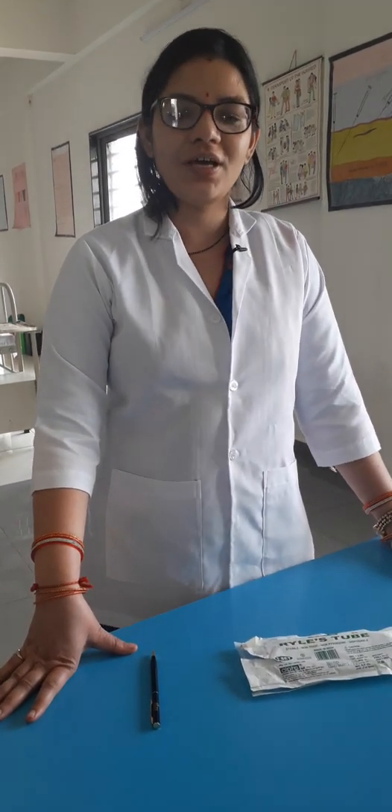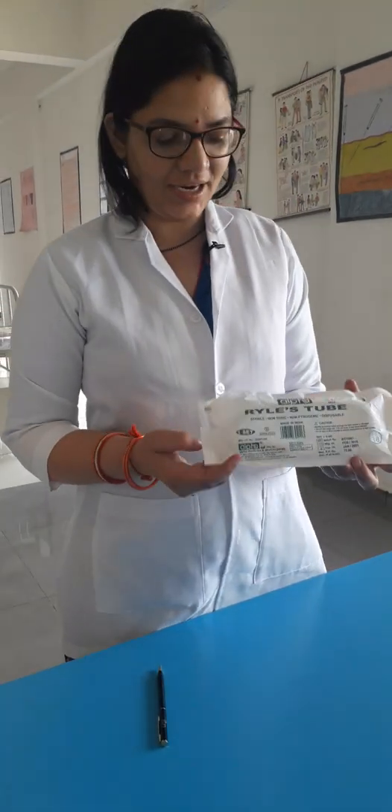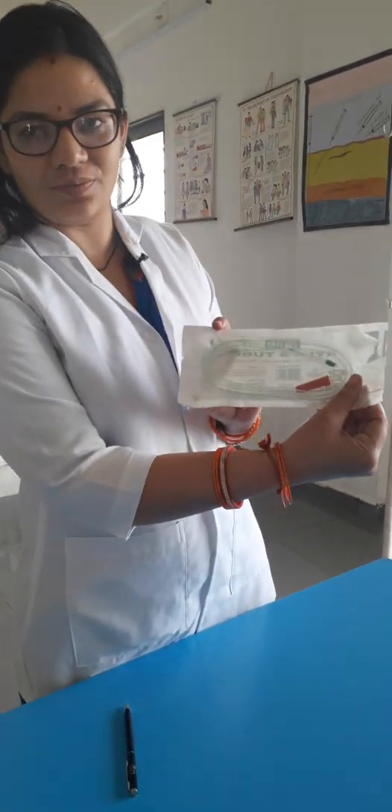Good morning students. Today we are going to learn about the Riles tube. As you can see in my hand, this is the Riles tube.